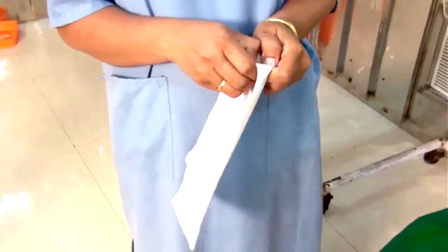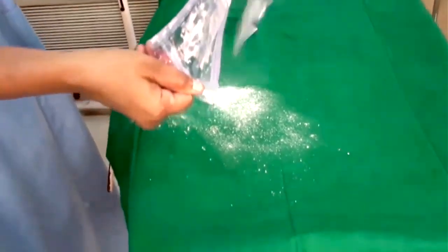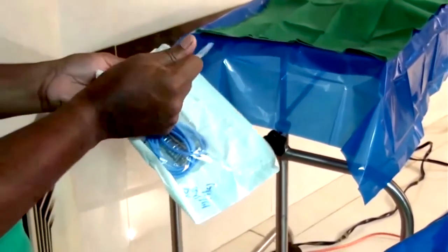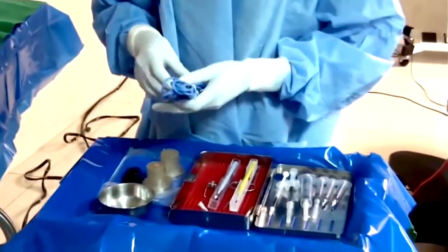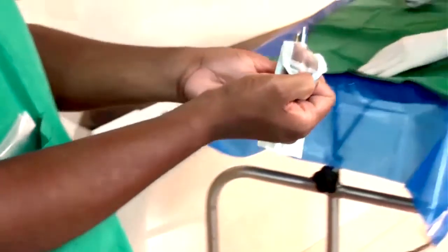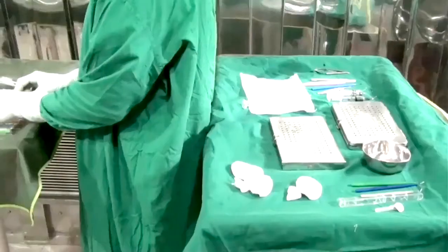Just to demonstrate that, I've put some powder on top of the pack and then tried to open it in the sterile field. You find that powder is dropping onto the sterile field. So whenever you're introducing it, it should be opened outside the sterile field, so that whatever deposits are on the cover don't fall onto the surgical field. This is the proper way of introducing sterile packs and instruments into the sterile field.